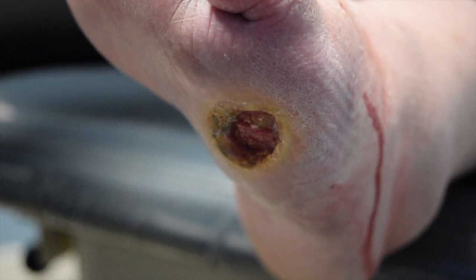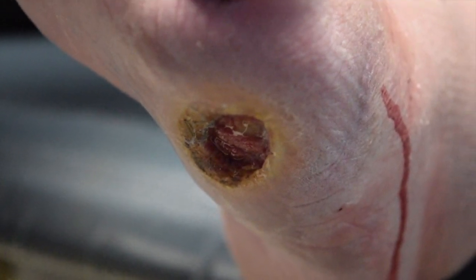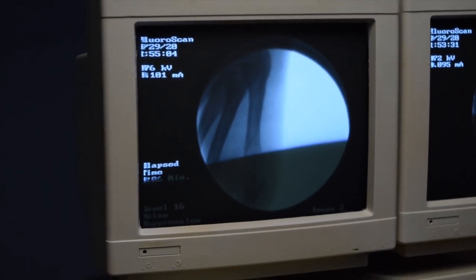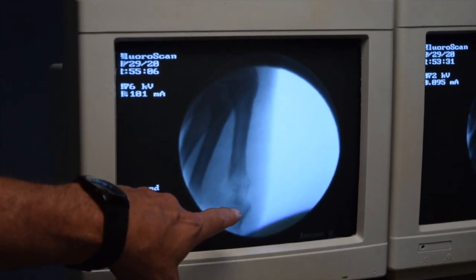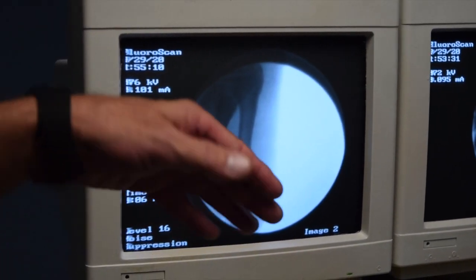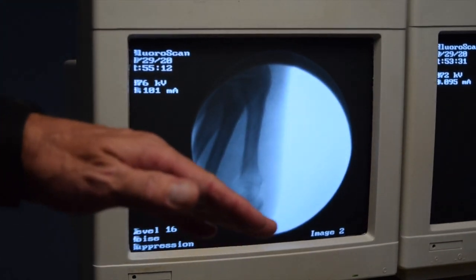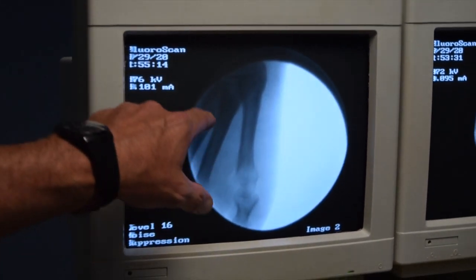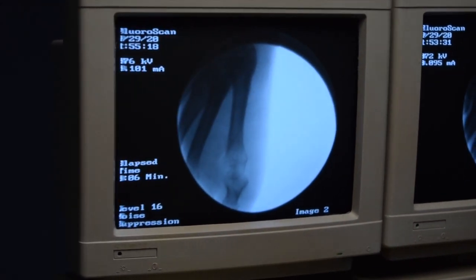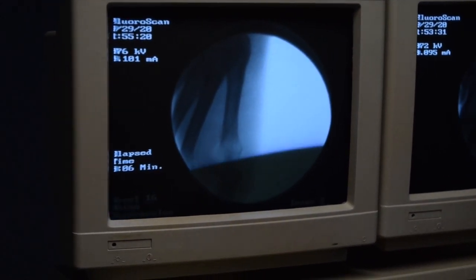She did have a MRSA infection most likely, though we did not culture it. If you look at our little pic here, you can see the fading out of the bone here which would indicate some osteomyelitis. So what we're going to do is go behind the bone infection and make an osteotomy to lift this off the bottom, which will give her pressure relief and make the ulceration heal.